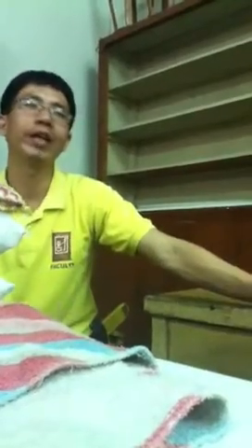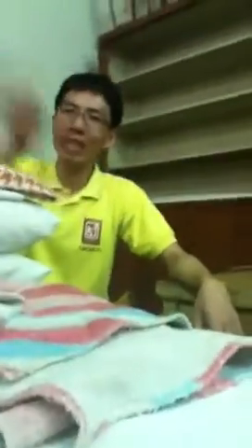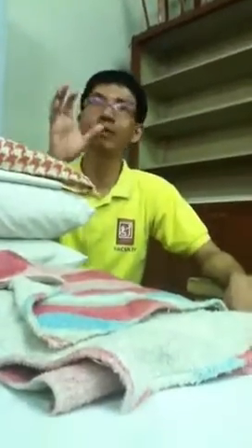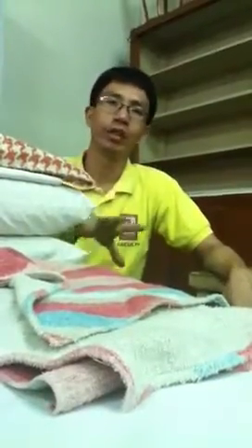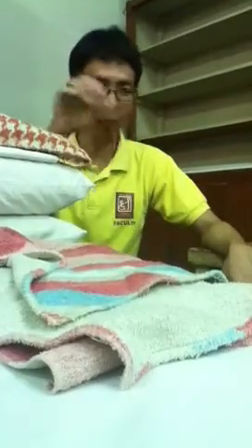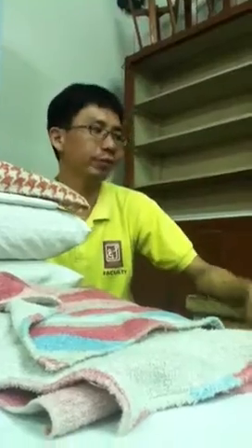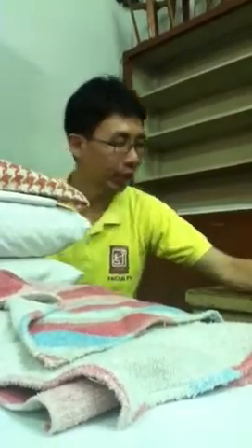For example, the low back: you have to move the head, and if the area is wider, you move the head over more. If the duration is short, by the time you return, your treatment time will have ended. We need to at least be able to return to the stroking you started, so if the area is larger, we usually prescribe a longer duration.